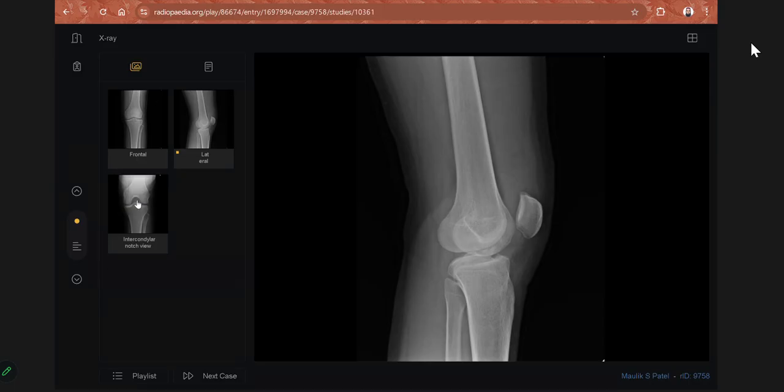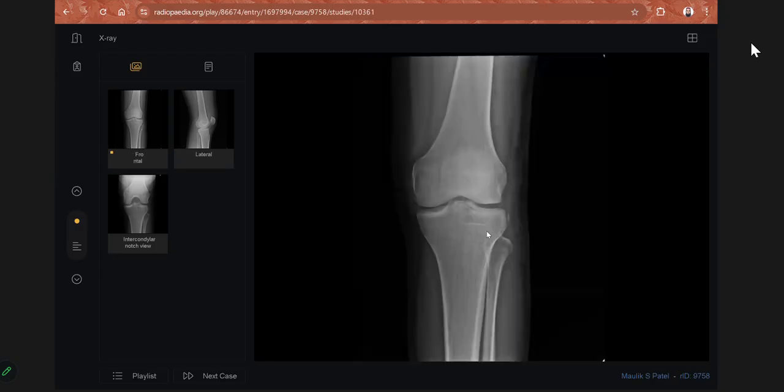Again, the same case was shown in my exam, but the injury was a tibial spine injury in a young patient. The examiner asked me what the finding is. The patient presented to A&E with trauma. There was a tibial spine fracture. Then abruptly the examiner said, maybe ACL injury, because this is a plain radiograph. You say maybe ACL injury. These are secondary features, so I want to confirm this finding on MR.